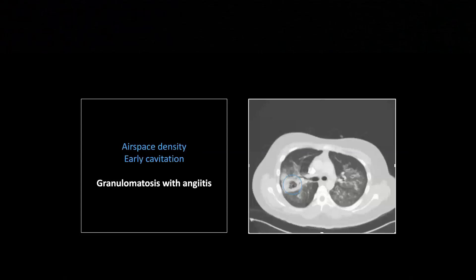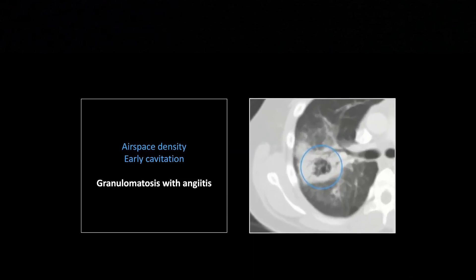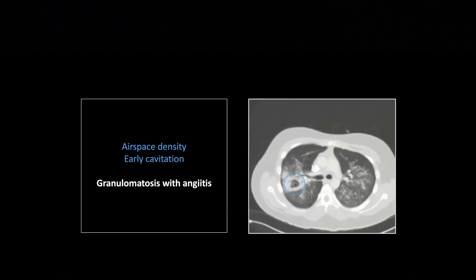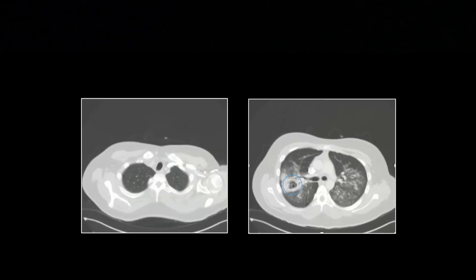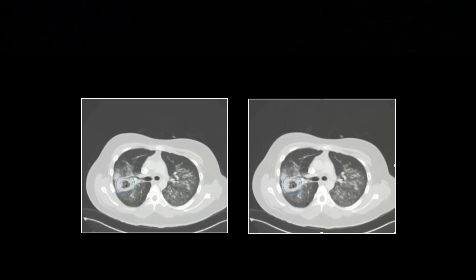Continuing with the destructive pneumonia phenomenon, here is a differential. There is clearly a focus of consolidation with a central early cavitation — you can see a cavity beginning to form. This could be destructive pneumonia, but don't forget your differential on airspace density: pus, blood, fluid, or cells. In this case, that's actually blood, so this is a case of Wegener's granulomatosis.